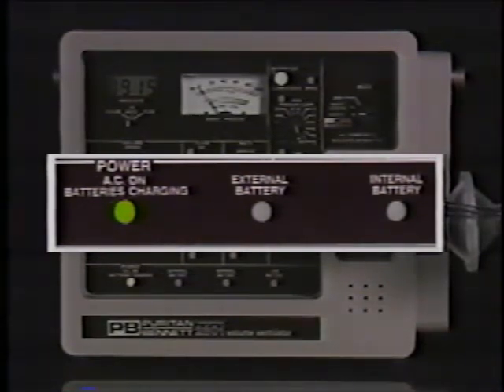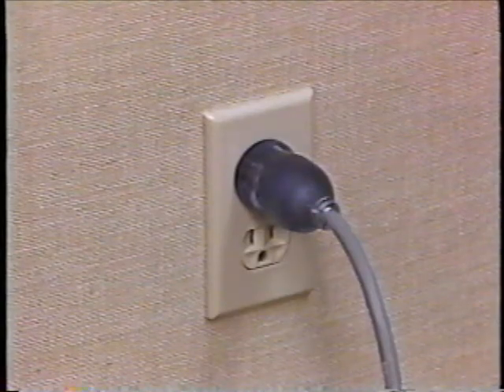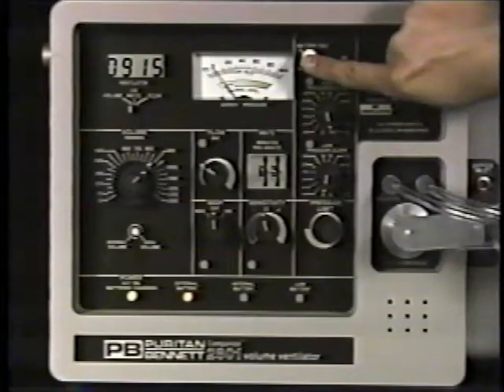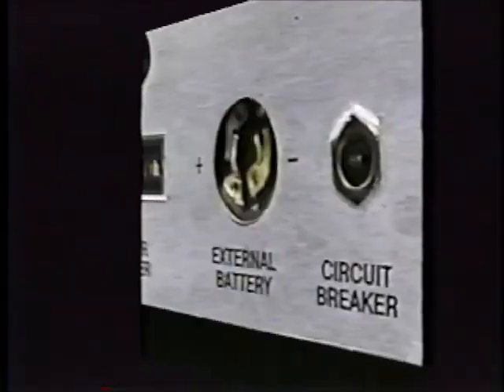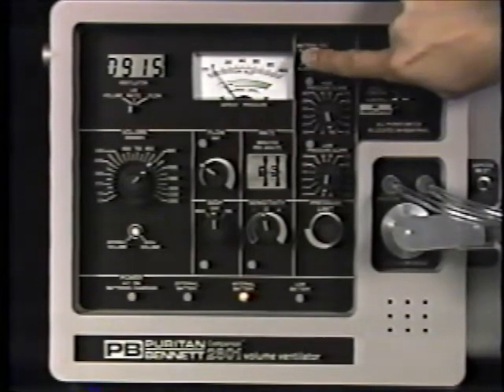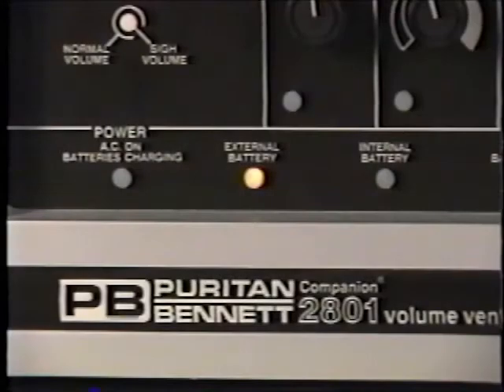When AC power is turned off or transfers to external or internal battery, the green AC indicator remains on momentarily. If the ventilator is plugged into an AC power outlet and an AC power failure occurs, the ventilator automatically switches to external battery power and an audible alarm sounds and latches on until reset. If an external battery is not connected, the ventilator will switch to internal battery power. If an external battery is connected and its charge is depleted, the same audible alarm sounds and the ventilator will switch to the internal battery.